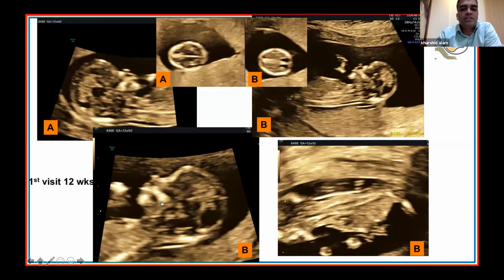Can you go through these images quickly? Yes, sir. In the combined first trimester screening, the chorionicity and amnionicity were reconfirmed, and it was a DCDA pregnancy. While measuring the nuchal translucency of fetus B, we noticed that the brainstem of fetus B was prominent as compared with fetus A. Also, the intracranial translucency was thinned out. We measured the brainstem to brainstem-occipital bone distance ratio, and it was more than the 95th percentile.